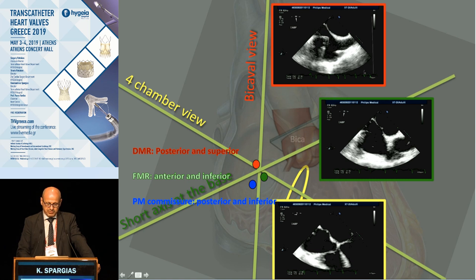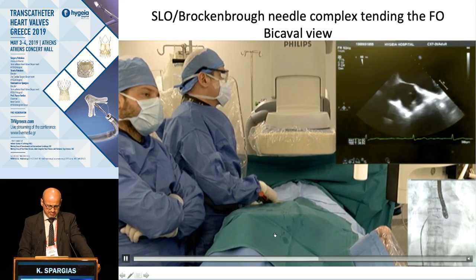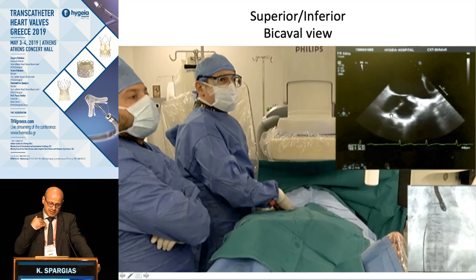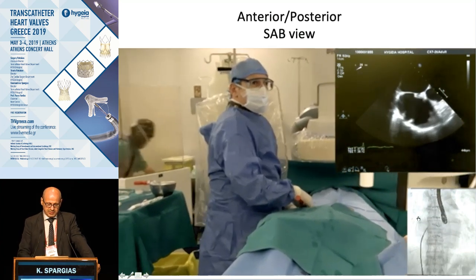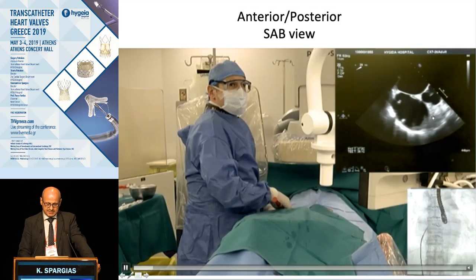How do we check our positioning? The bicaval view confirms superior-inferior position. The four-chamber view checks height in relation to the mitral annulus. The short-axis view at the base checks anterior-posterior orientation. It's straightforward once you know the views. Here we see the tenting, and when we are satisfied with how superior we are, how anterior-posterior we are, and the height we have, we then advance the SafeSept first.